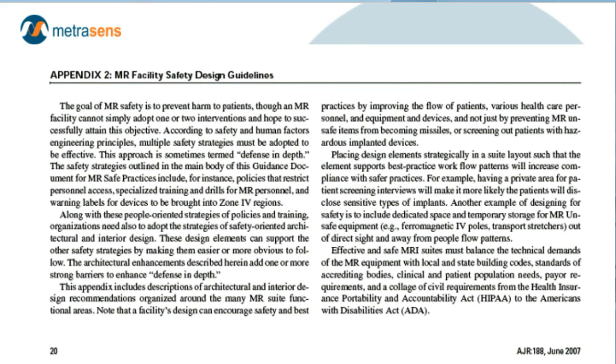MRI Facility Design Guidelines, MRI Facility Safety Design Guidelines. It essentially walks you through functionally how these facilities are used. It explains the zoning, it explains the individual elements of a number of clinical operational processes and how that should be shaped by the physical environment. If you are a designer, I strongly encourage you to read through this section as a part of any MRI facility planning job.